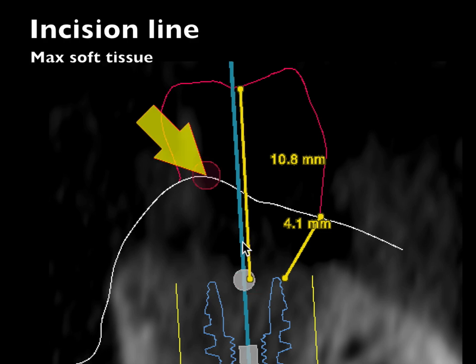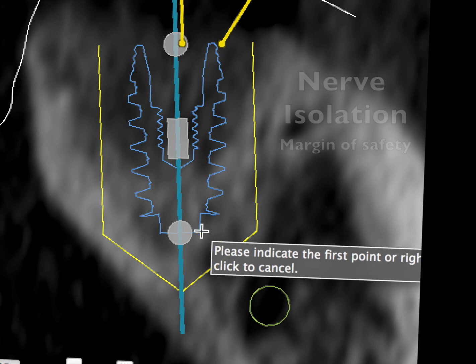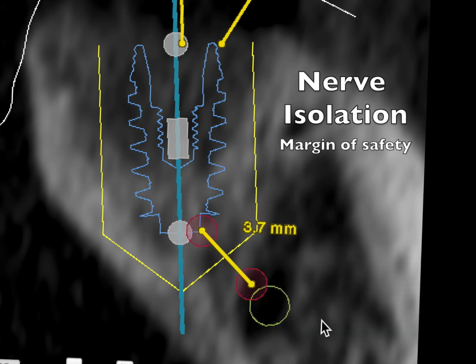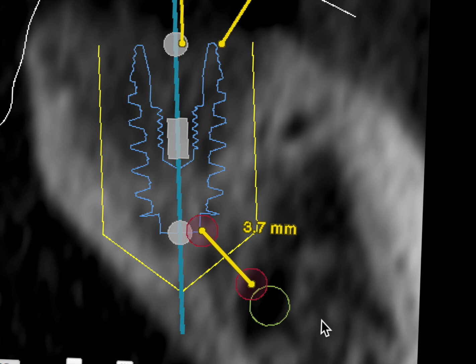We can also look at the incision line. The tissue thickness is very great here, so we want to bring this tissue to the facial and increase our thickness out there — we don't want to punch here. Lastly we'll look at the distance to the nerve: it's 3.7 millimeters, so we have lots of space. We can plan this and do the surgery with relative ease, but this is something we want to isolate and make sure we know the position of the nerve.